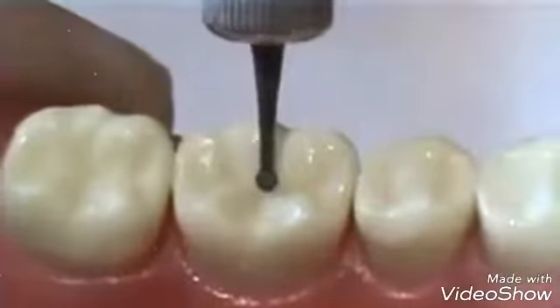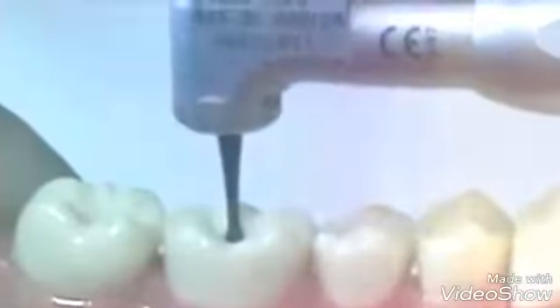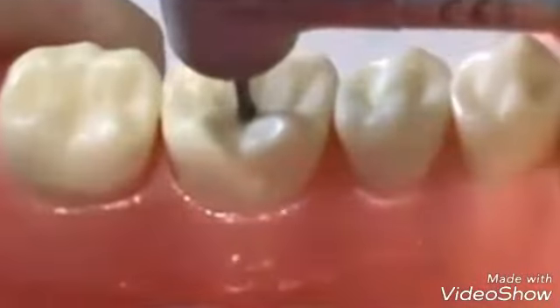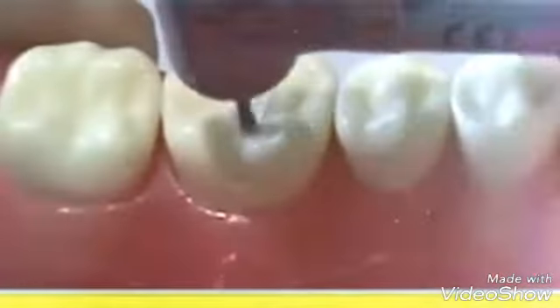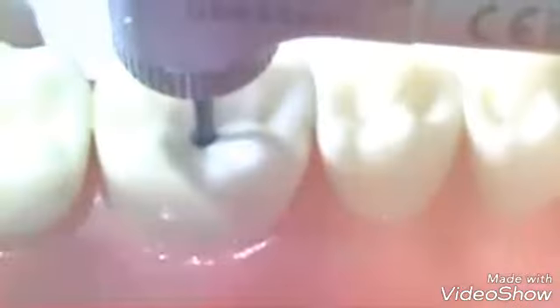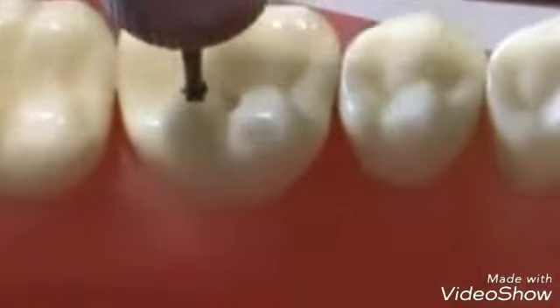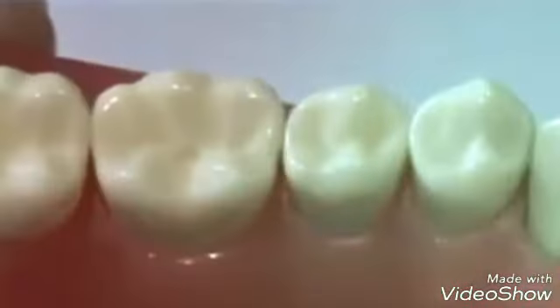This is done by the use of a round bur 1 mm in diameter. The bur is put perpendicular to the occlusal plane at the depth of the fossae. The depth of the cavity should be 1.5 mm to 2 mm. After cutting, we could check the cavity depth by placing the bur in the cavity. We should see that the bur sinks into the cavity.